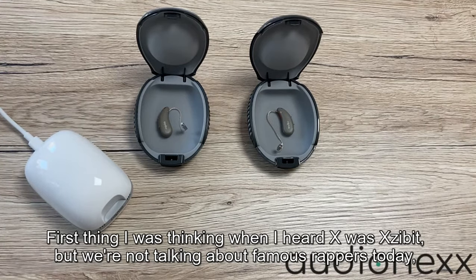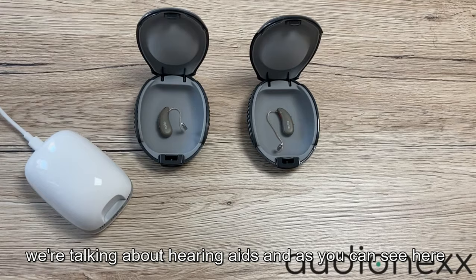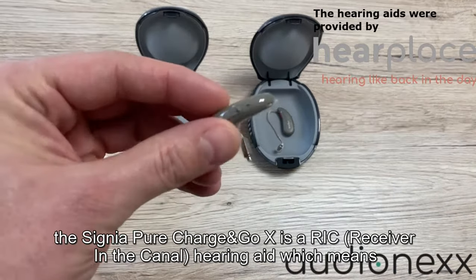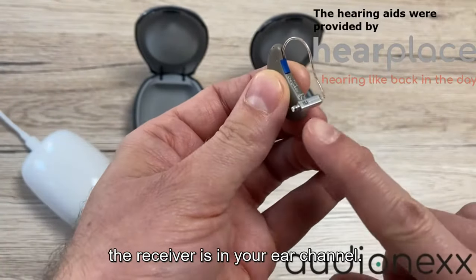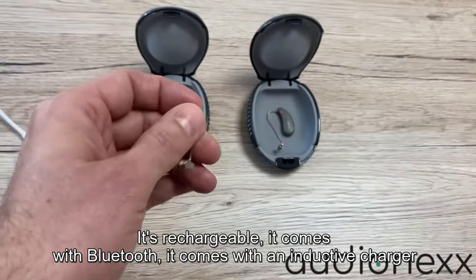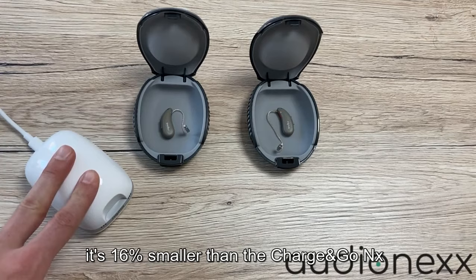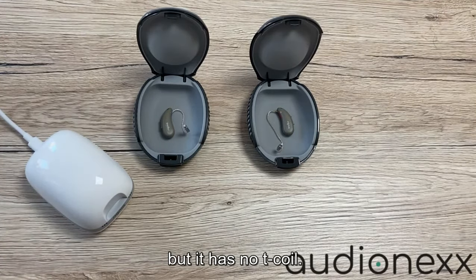The Signia Pure Charge&Go X is a RIC hearing aid, which means the receiver is in your ear canal. It's rechargeable, it comes with Bluetooth, it comes with an inductive charger. It's 16% smaller than the Charge&Go NX, but it has no T-coil.